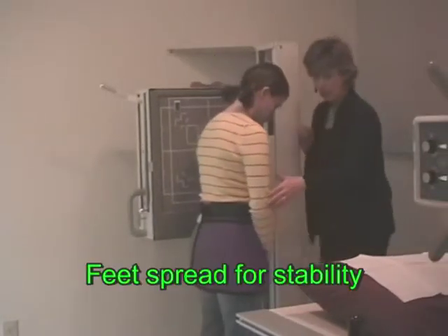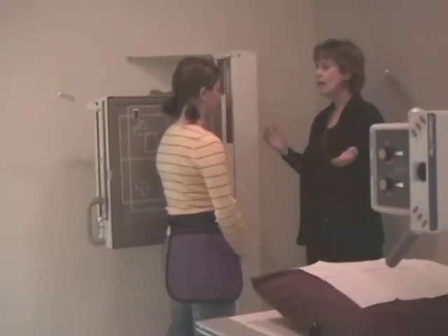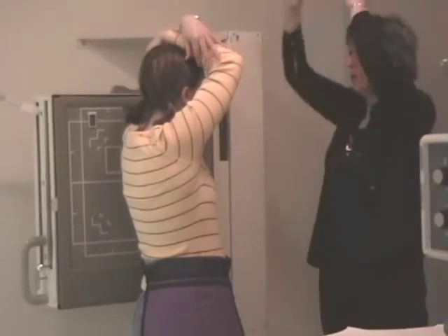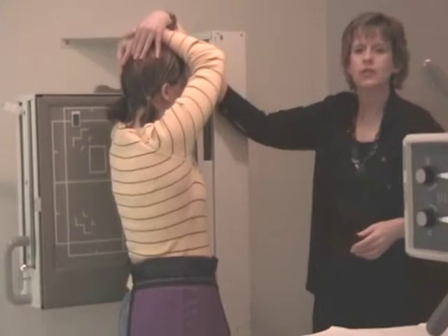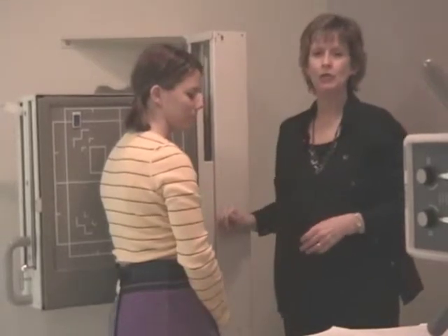Have her feet spread, again, for stability. And we want her, can I have you raise your arms over your head, please? Bring them close. That's good. Can you bring your elbows in? Okay. Those are the instructions that you would give to the patient. We're going to let Drea relax for a second, though, because I don't want her to have to hold that position. I want you to practice this.